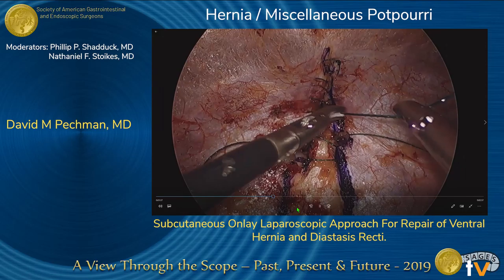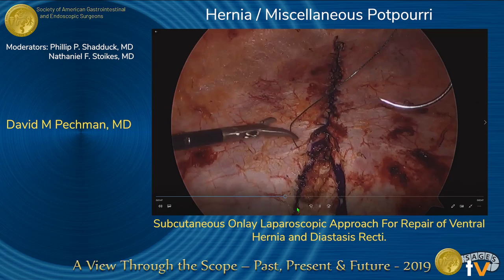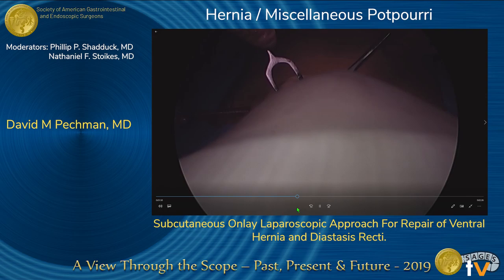The suture was continually tightened as we continued inferiorly. Care was taken to ensure bites were substantial but shallow enough to avoid risk of intra-abdominal injury. The inferior aspect of the placation was completed via open approach through the 3-centimeter suprapubic incision.